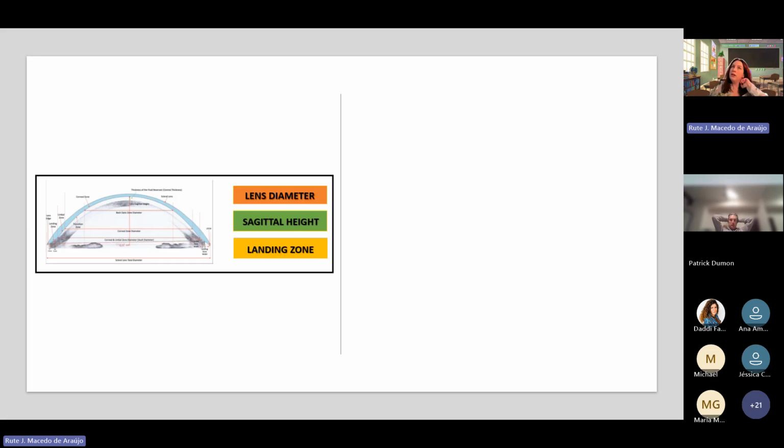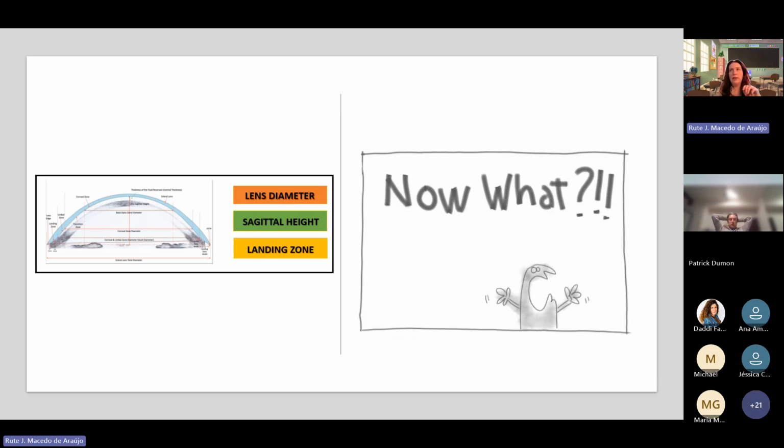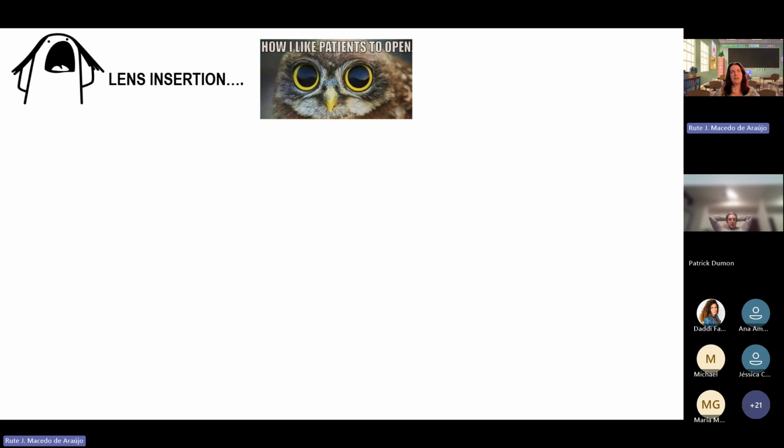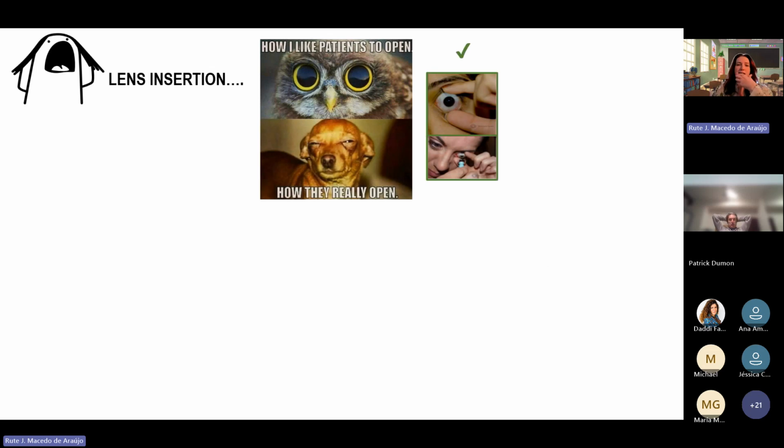that patient. So we talked about how to select the lens diameter, how to select the sagittal height, and how to select the landing zone. And now, okay, we selected our lens, and now we need to insert the lens on the patient, right? And this could be a nightmare sometimes, because we need the patients to have the eyes wide open, because the scleral lenses are big, but it doesn't happen that way.